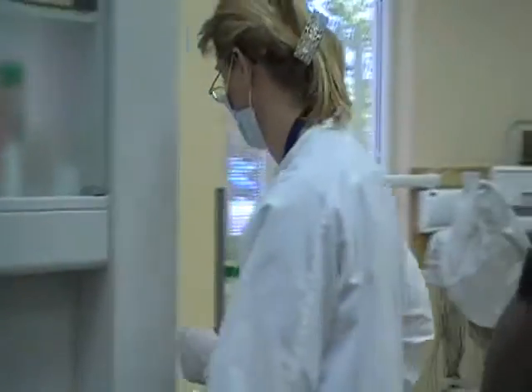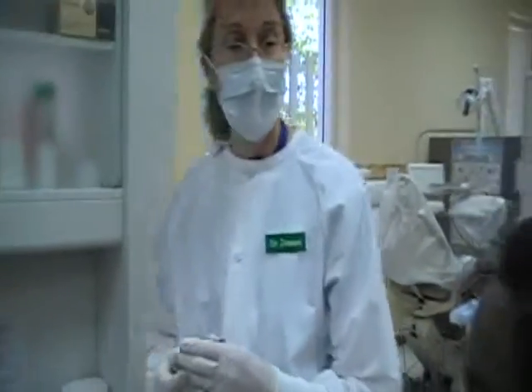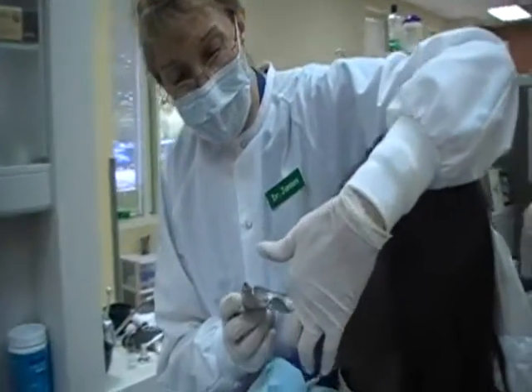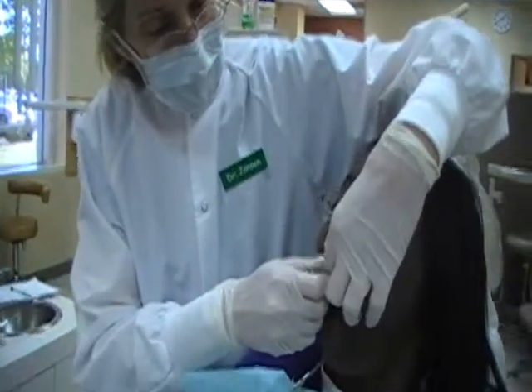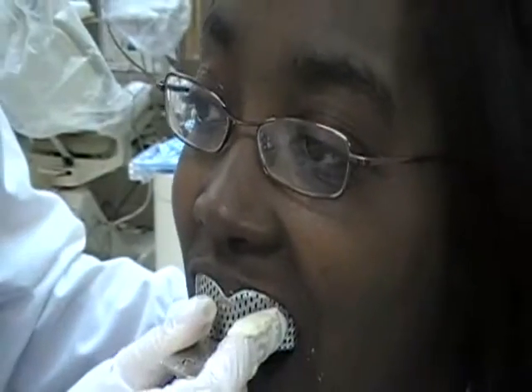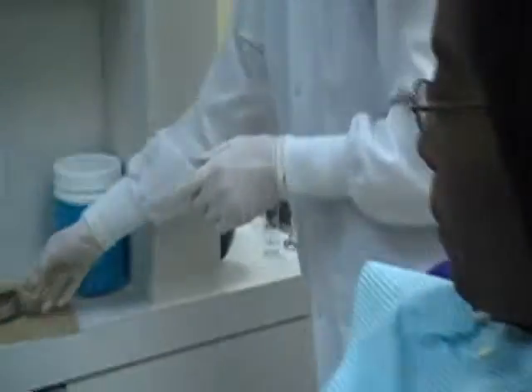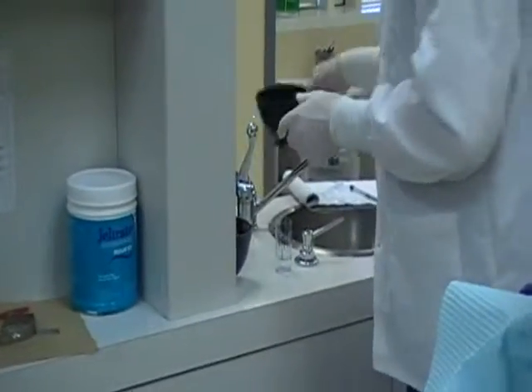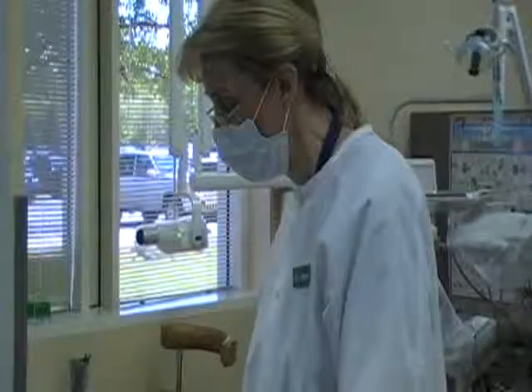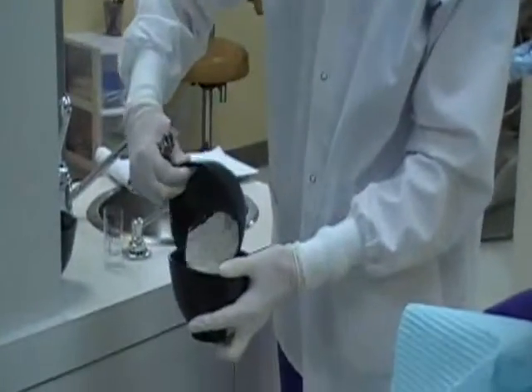The next impression we're going to do is the maxillary. For the upper impression, once I place it in your mouth, the instant I do that, what I want you to do is come off the chair — your back fully off the chair — and be breathing through your nose. I've already added the powder and the water, and I'm now adding my powder again to my liquid.